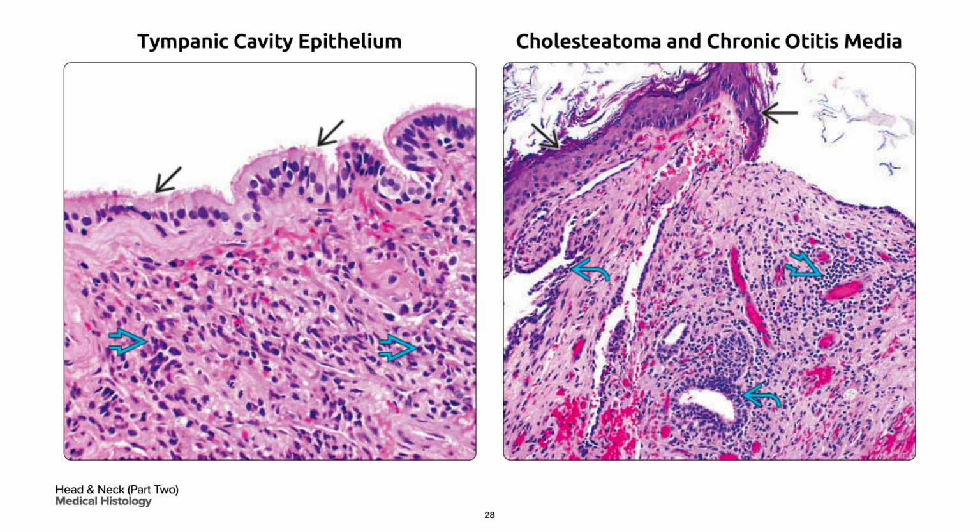On your right, your squamous epithelium, which is not present under normal circumstances, is in the middle ear. Its presence indicates a cholesteatoma in a single black arrow, as seen here. These are often associated with chronic inflammation in bold blue arrow and glandular metaplasia in curved blue arrow, indicating chronic otitis.